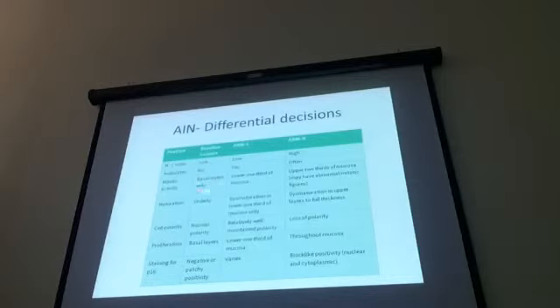That will be basal layers only in reactive lesions, whereas you may get some upper level staining with the low-grade lesions. Maturation, polarity, proliferation, that's the same as mitotic activity, and then the staining. So these are the tools that you have histologically to make the differentiation.